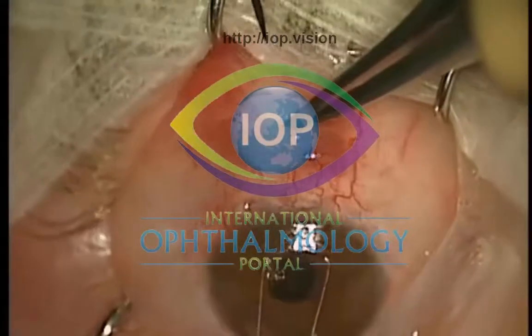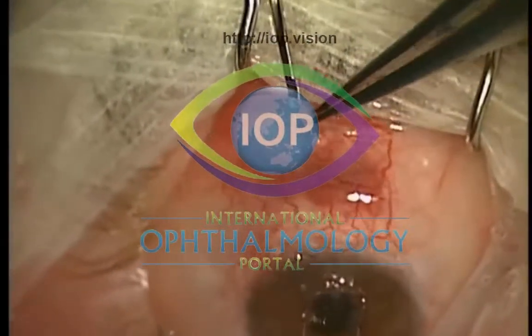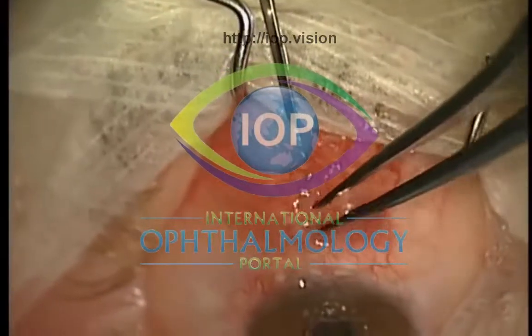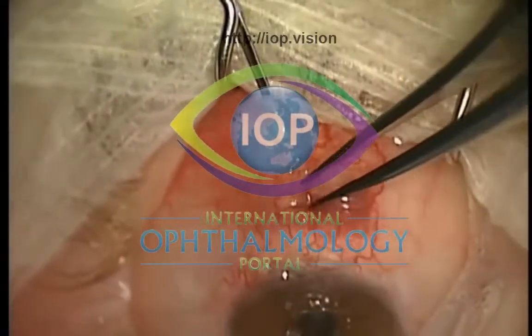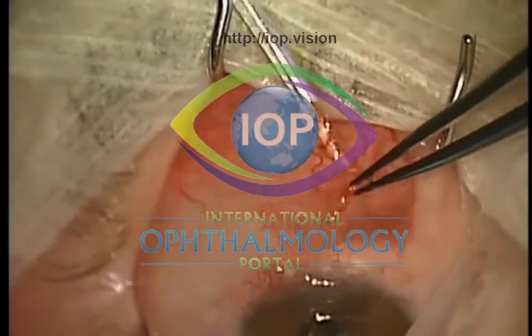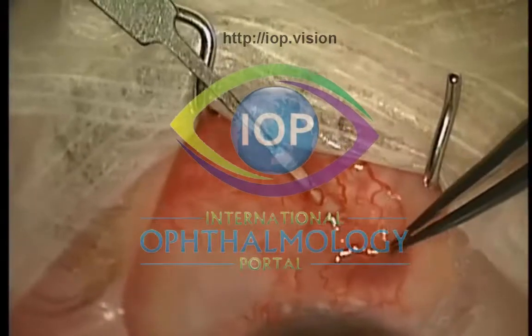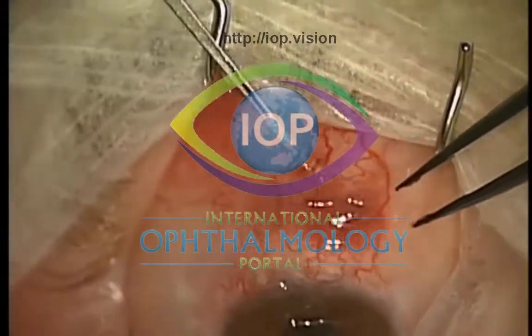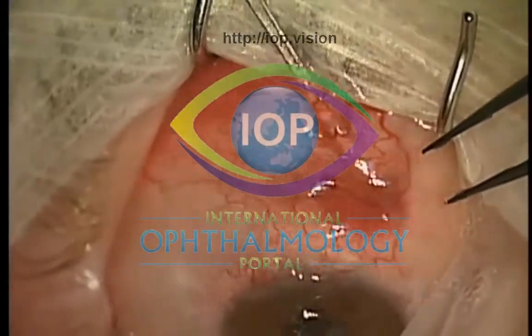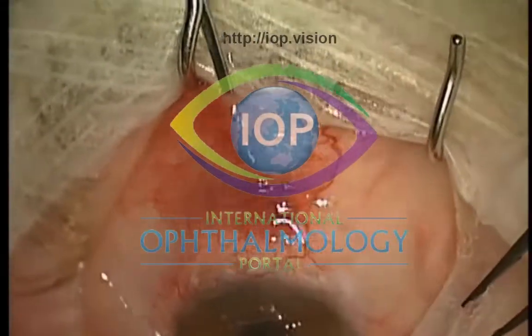Is there a reason you use 2.5%? From my practice, I'm fairly minimalist on all adjuvant therapies — 5FU and even mitomycin. I always go for the lowest dose possible on the grounds that anti-metabolite-related complications are the single most common cause of loss of eye. But in the bleb-needling scenario, it's particularly because you can't always control whether the patient has involuntary blepharospasm afterwards. After topical anesthesia, patients can develop blepharospasm, and I worry a little bit about the limbal stem cells and the ocular surface.